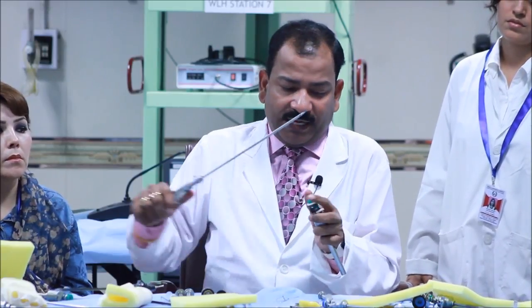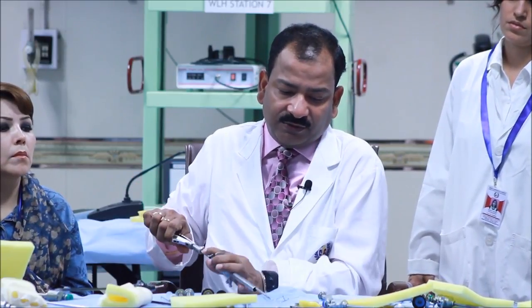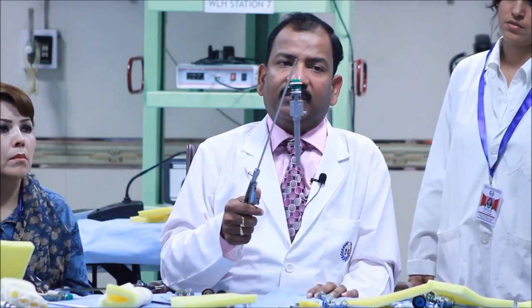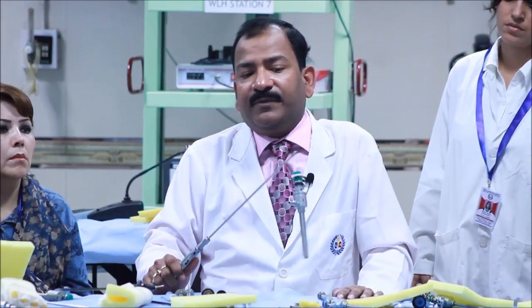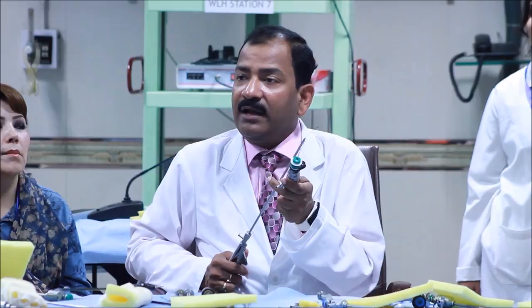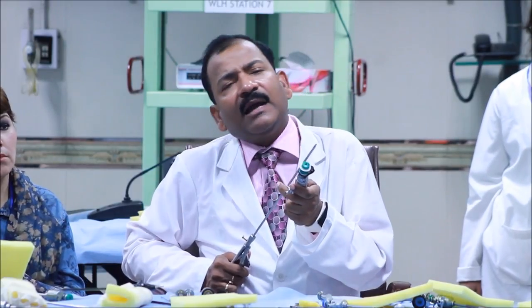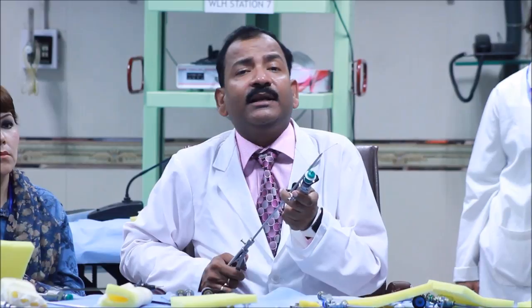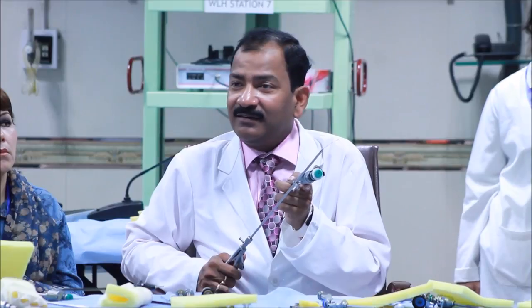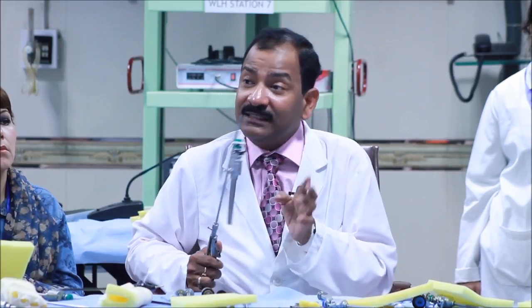Without the reducer, if I try to take it by the top mounted, and I am holding the suture and trying to take it out, see, the suture is trapped by the wall and it may break. There was one very funny but interesting article, that they lost the needle and for 6 hours with the C-arm, they tried to find it out. Ultimately, one resident saw it was in the cannula. It was broken, yes. They did a laparotomy and with the C-arm for 6 hours looked for where the needle had gone. And the needle was in the cannula. In the cannula, the C-arm also cannot see, because it is metal. So, this is one of the possibilities.